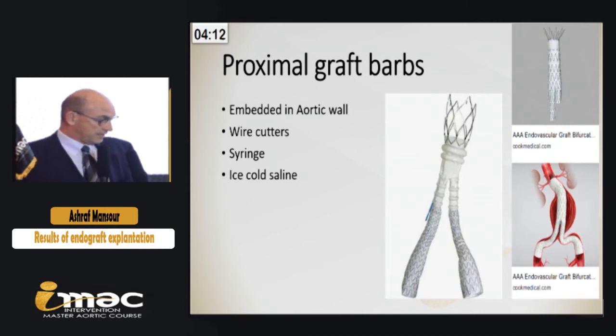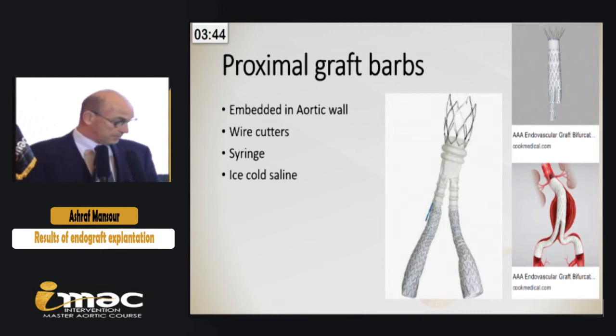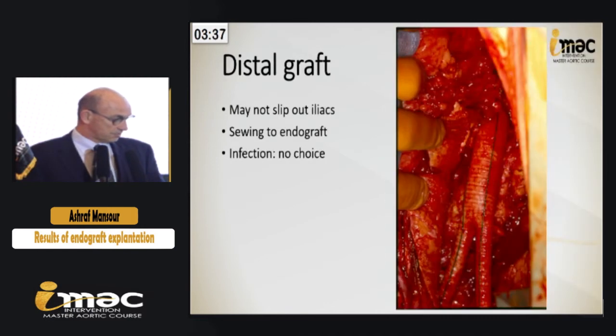Dr. Tawfiq said that he took out an Ovation graft, and this is probably the biggest nightmare in terms of having these stents go all the way up to the SMA, making it incredibly difficult to remove. I've had the pleasure of explanting Zenith stent grafts, and I can tell you that it's not an easy operation, and that you have to use some tricks to facilitate this. And one of the tricks that maybe will come up in the discussion is to use ice-cold saline on the nitinol part to try to get the stents to shrink.